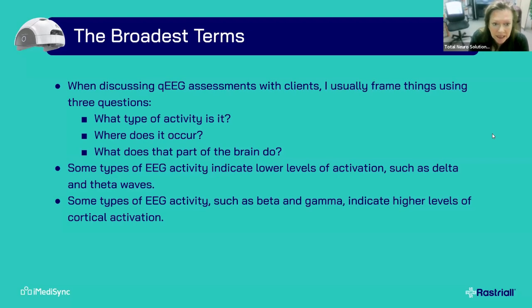So what's awesome about EEG is when we do all of this analysis and we're thinking in layers, we're thinking, hey, what's the chief complaint of the client? What do I see in the raw EEG? What do I see outside that normative database comparison? What do I see in the Brodmann areas? What networks do I tap into? By thinking in layers with all of those, we can come up with a good list, narrowing in on a functional reason why your client has this presentation.